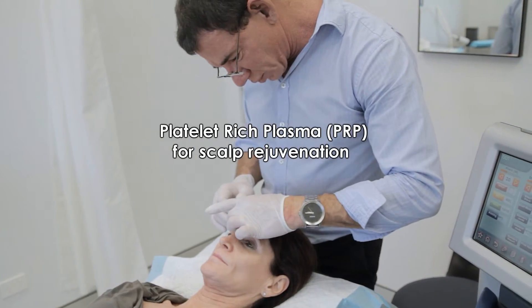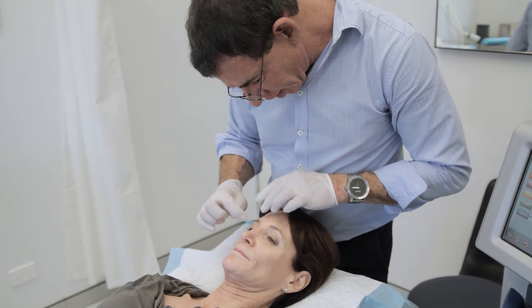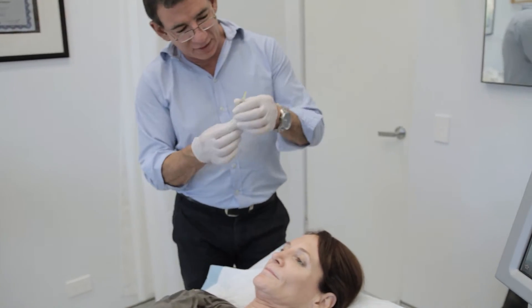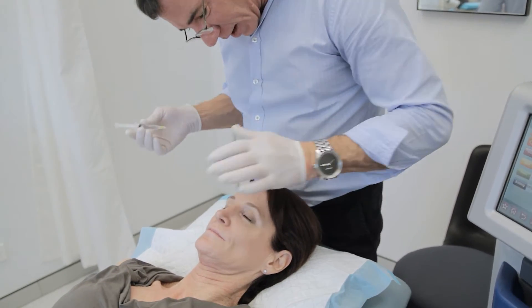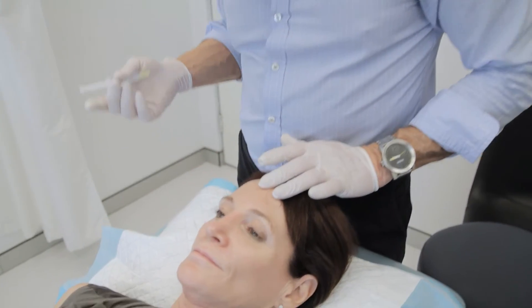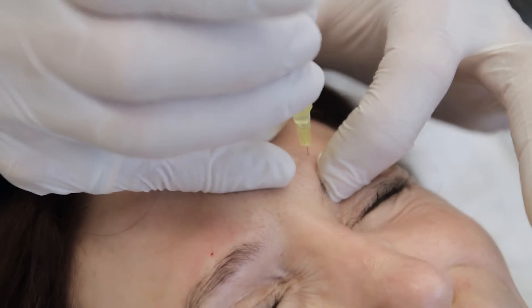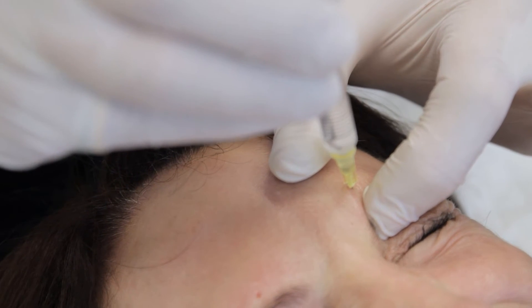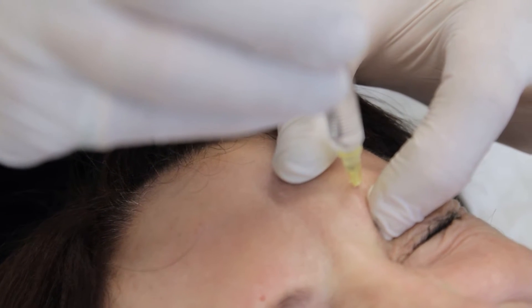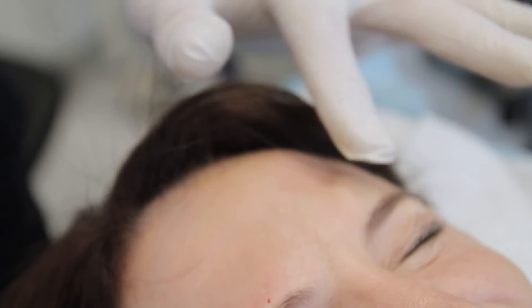What we do is feel for the supraorbital notch — you can feel it very clearly in Kate there — it's level with the inside of the iris, the medial limbus. This is 2% lignocaine plain with no adrenaline. I palpate the notch, put the needle straight down through the skin until I touch the bone, and then inject right off there — 2ml of plain lignocaine. It seems like a fair bit but it's going to do the job.